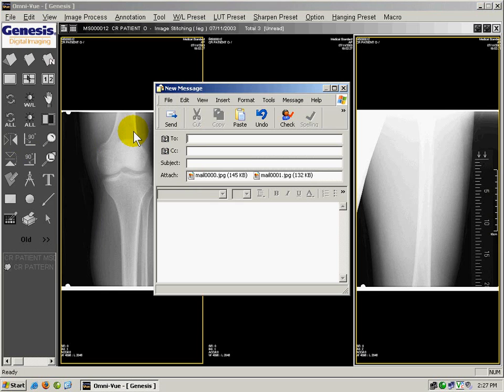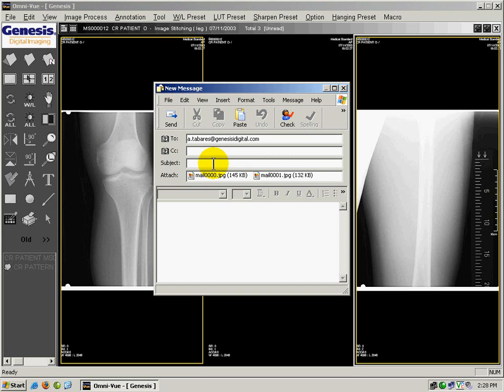I enter the email address of the person I'd like to email the images to, and in the subject line, I can put the patient name or patient ID. When I'm done, I click Send.